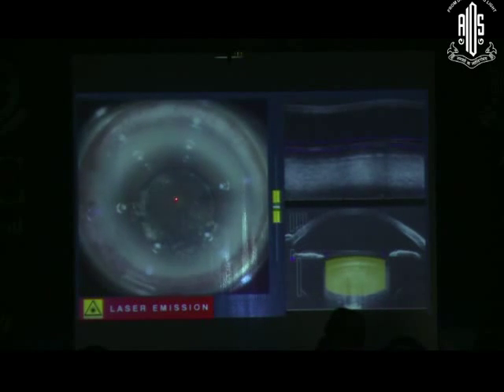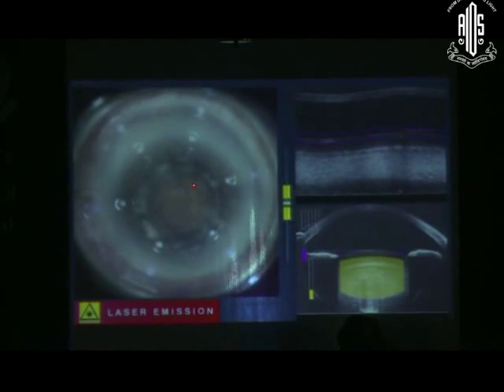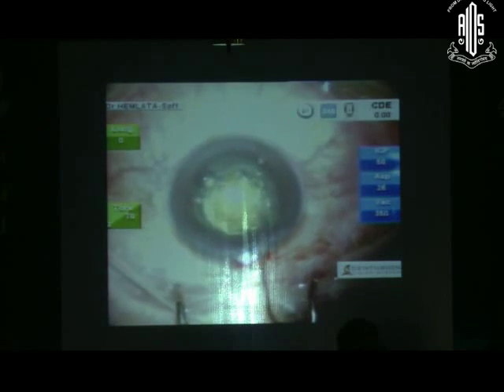It is considered that in a posterior polar cataract, the safety increases when you are doing a femtolaser, because you are actually making these quadrants which are higher up, and you are leaving an artificial posterior capsule in the form of a cushion. So we are doing this, and you can see the fragmentation, but you can see that there is some air which is getting trapped here. I really don't know whether it had something to do with that, or in itself it looked like a very dangerous posterior polar. But let's just see.